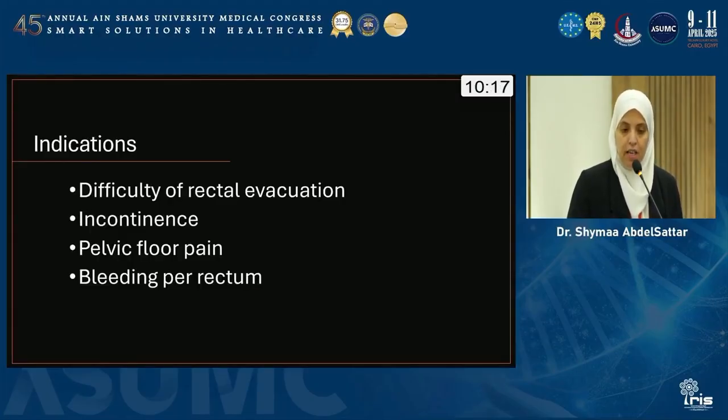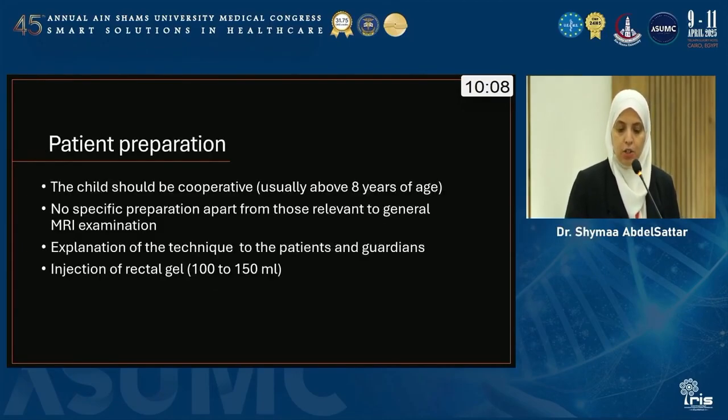MRI defecography indications: difficulty of rectal evacuation, incontinence, pelvic floor pain, or bleeding per rectum. Patient preparation: the child should be cooperative, usually above 8 years of age. There is no specific preparation apart from that related to a general MRI examination, explanation of the technique to the patients and the guardians, and finally injection of rectal gel after acquiring the basic sequences.